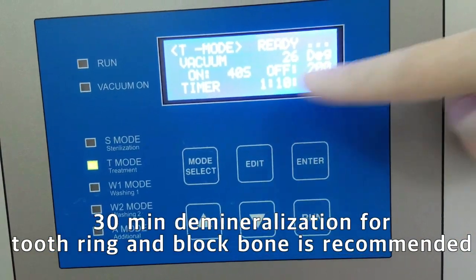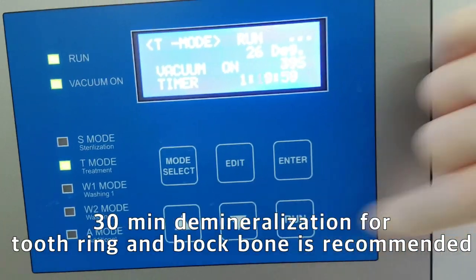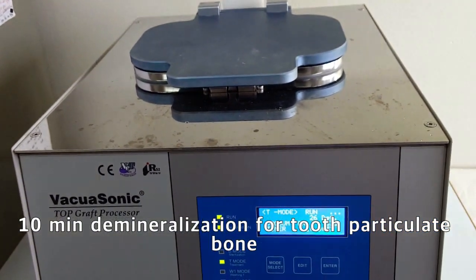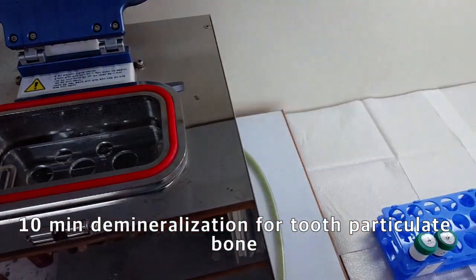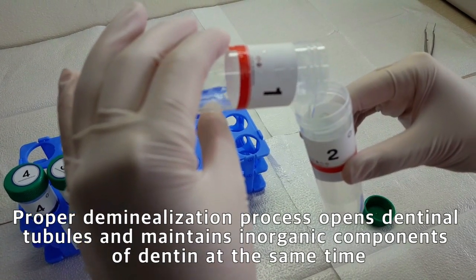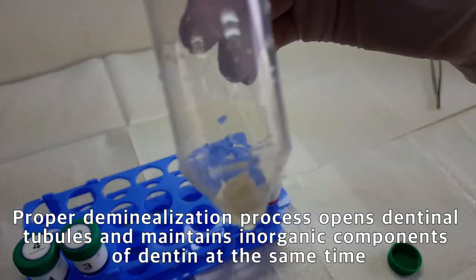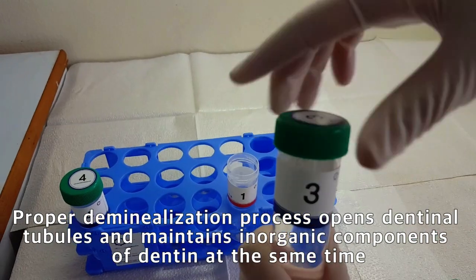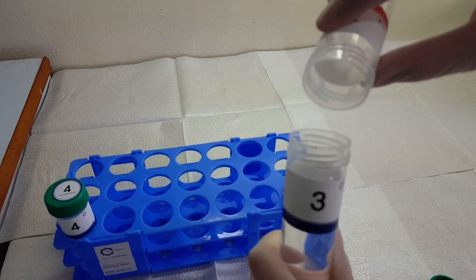30-minute demineralization is recommended for tooth block and tooth ring bone. 10-minute demineralization is recommended to prepare particulate tooth bone graft. After the effective demineralization procedure, the inorganic components of dentin can be reduced and the calcified dentin can induce release of diverse osteoinductive proteins.